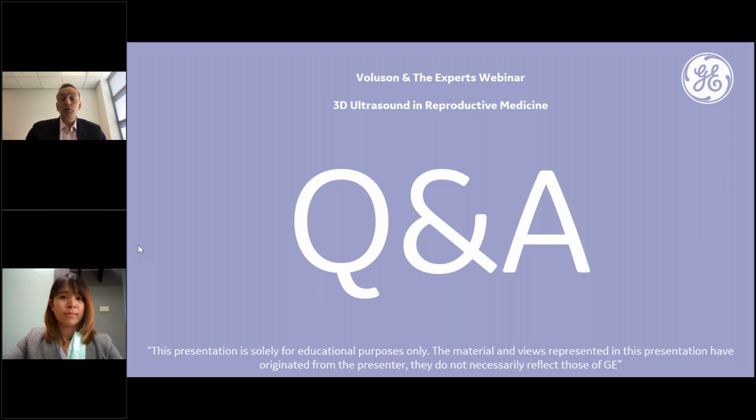And if it becomes homogeneous too soon, that's detrimental, because you've got to have the right estrogen progesterone ratio and change to make it receptive. And that's the concept of the ERA study, the endometrial biopsy and the genetic assessment. So the endometrium has a genetic receptivity picture. So I would urge you, don't just focus on thickness, measure it, but look at the pattern, spend more time focusing on what the endometrium looks like and how it changes across the cycle or within the IVF cycle.